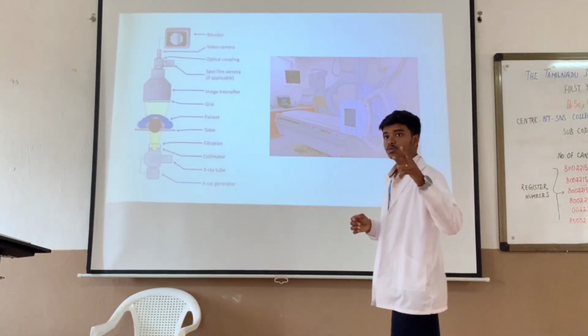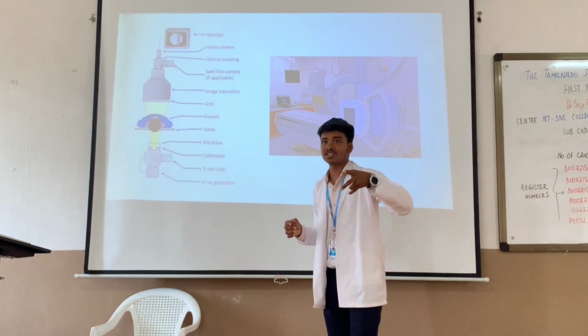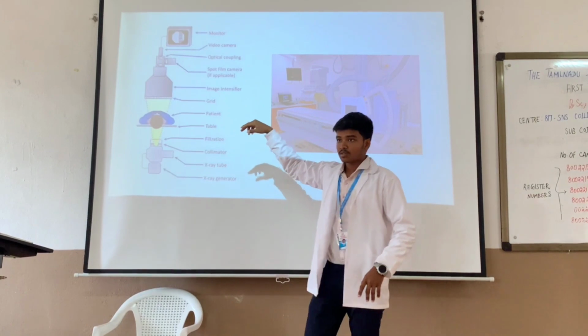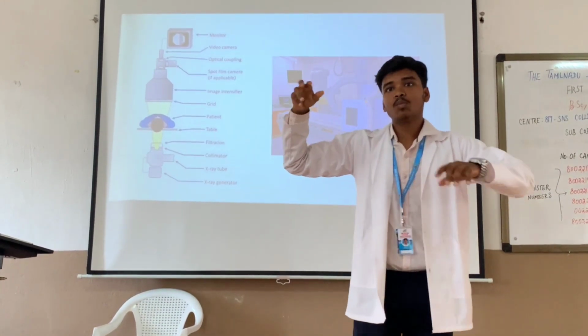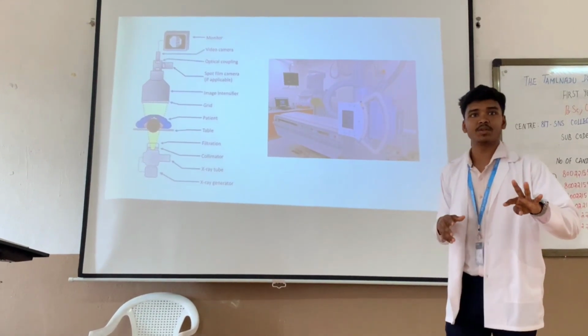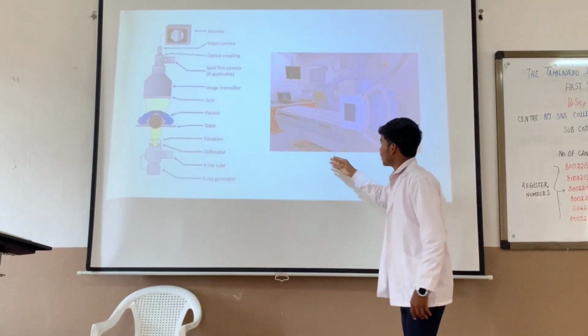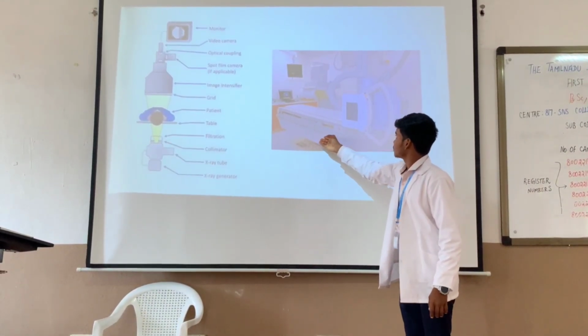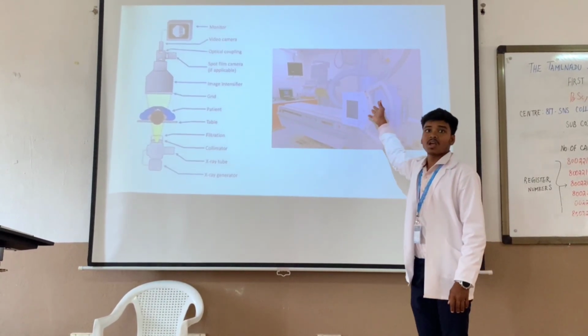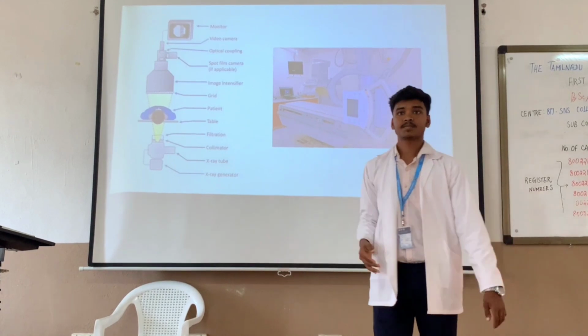There are 2 types of X-ray tube positions: under the patient and above the patient. The fluoroscopy unit contains both X-ray tubes. The X-ray tube is placed under the patient, and you can also use the X-ray tube which is above the patient.